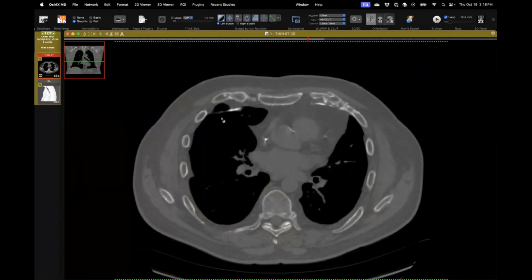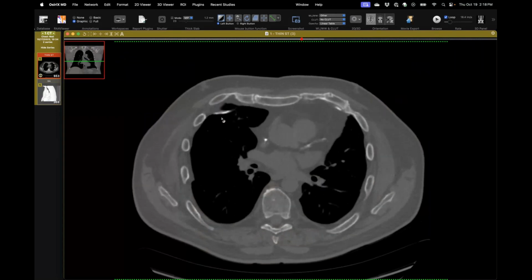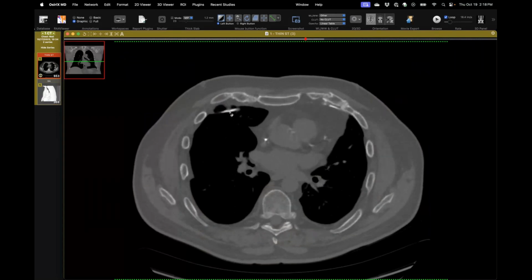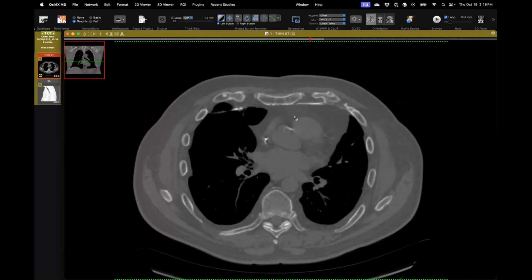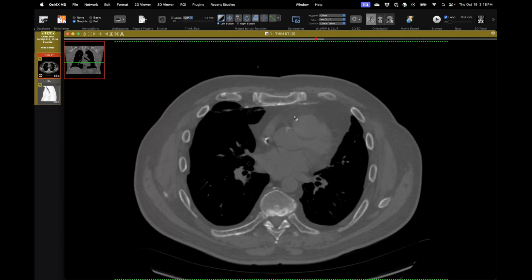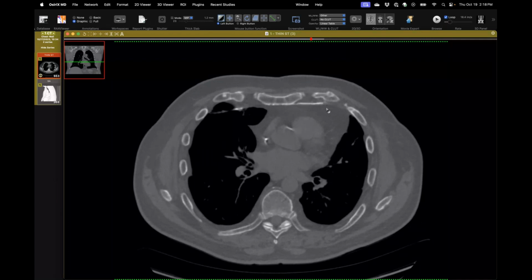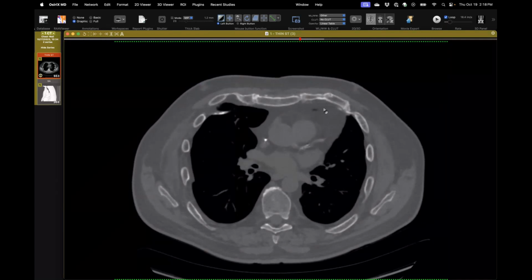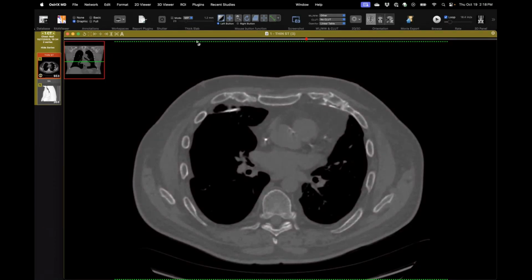It's just kind of interesting that we see it. They don't get in the lung, so it's just kind of pushing up, tethering the pleura a little bit there. But I presume it either caused some dystrophic calcification or the bar did something to the periosteum, and this is actually cortical bone here. But I've just not seen that before. It's just kind of an odd finding. I still see these done every so often, but I've never seen one long term.